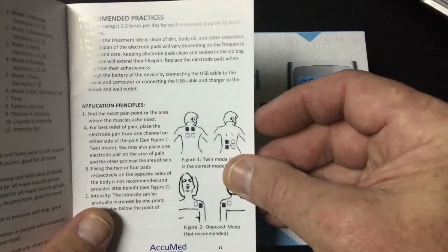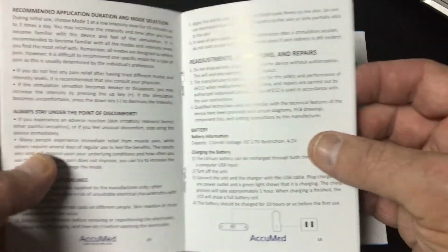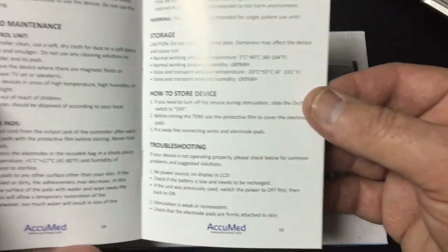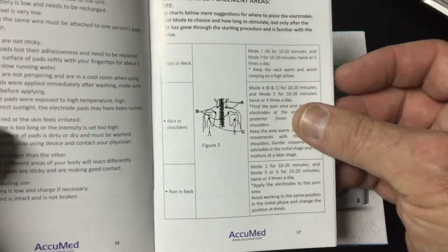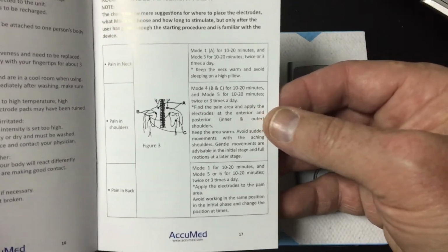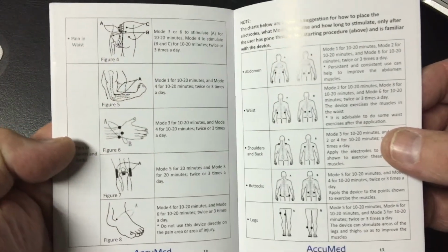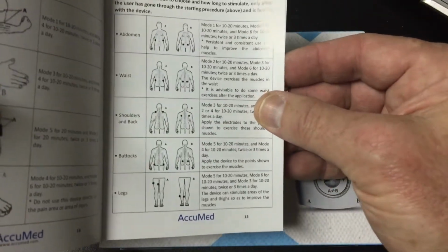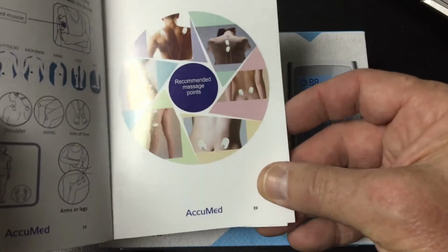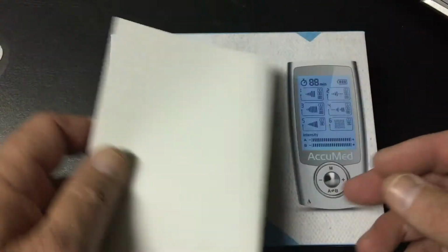Okay. Then it goes into some application principles that shows you some diagrams of where to place the electrode pads. Tells you how to clean and maintain the unit, store the unit, troubleshoot. And then in the back of the book, you have more information on placement of the electrode pads. So there's a lot of good information here. And again, do not neglect the user manual. Read it.